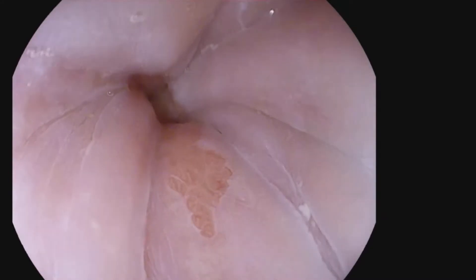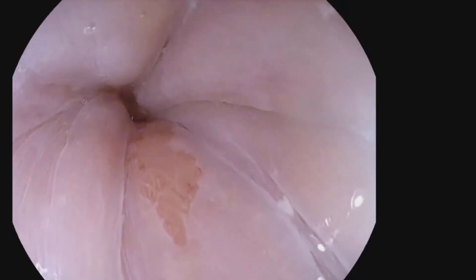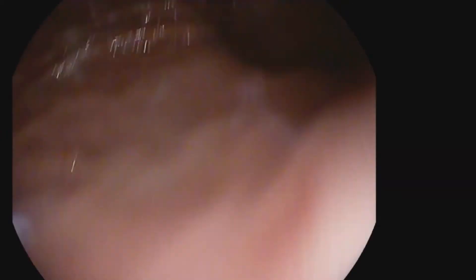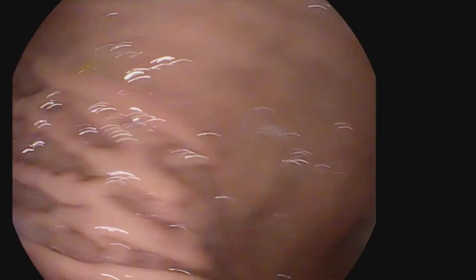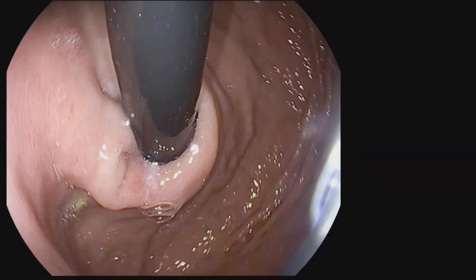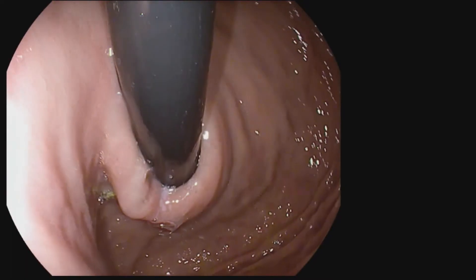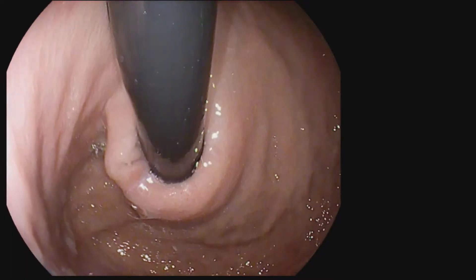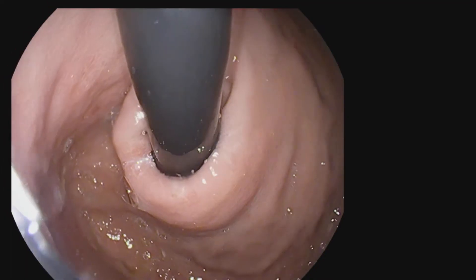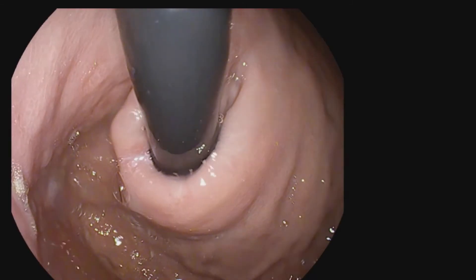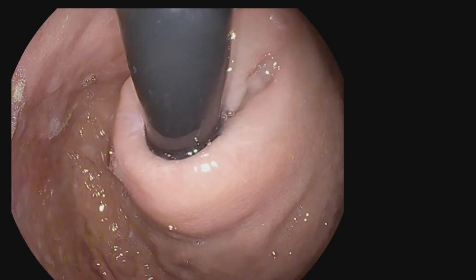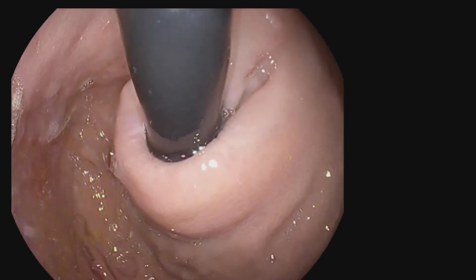As you can see in this video of a Hill-grade 1, we are looking under retroflexion and the valve stays tight around the endoscope during the entire examination. The valve does not appear to change much with inspiration and there is a significant folded flap present.